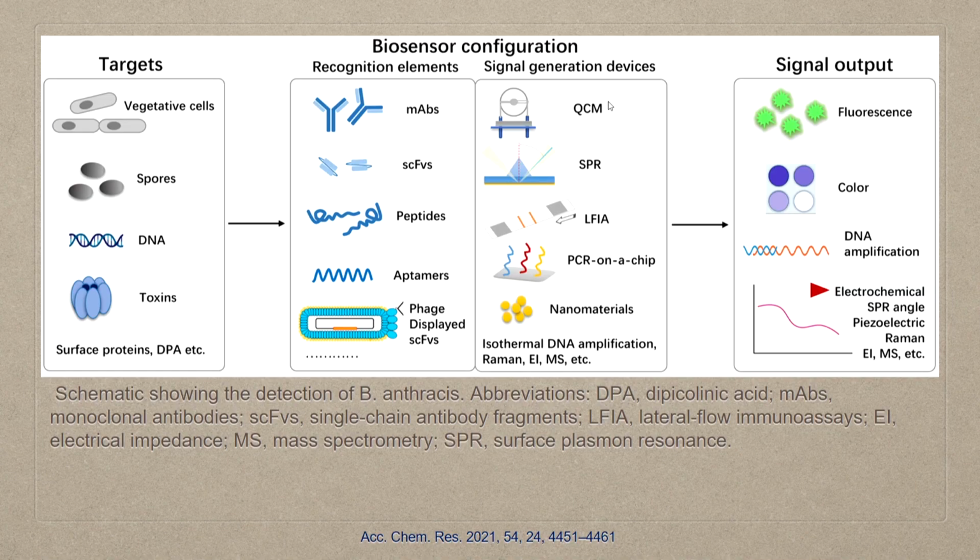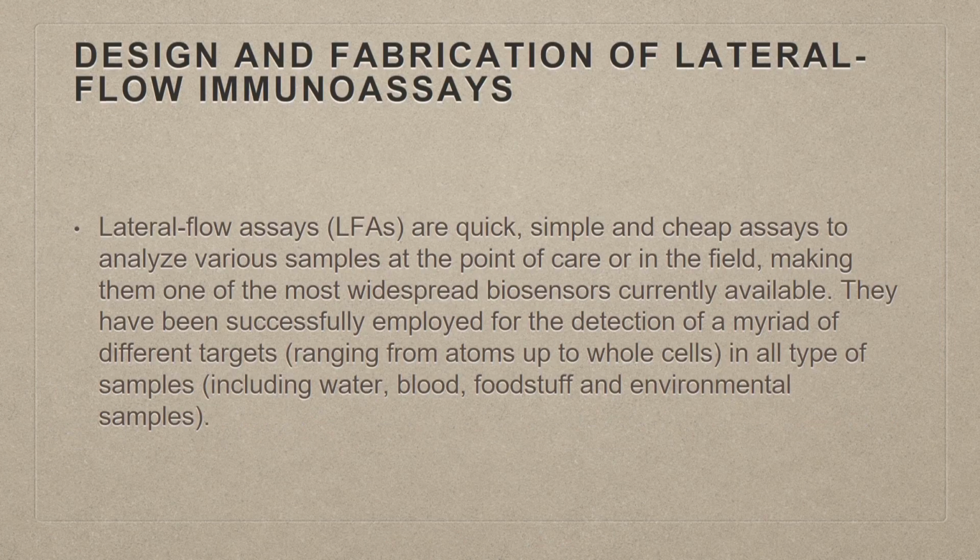So we will be talking about signal generation devices, which is LFIA, lateral flow immunoassay. As the name indicates, it's an immunoassay. It means there has to be antigen antibody reactions. So today's class title will be design and fabrication of lateral flow immunoassays.